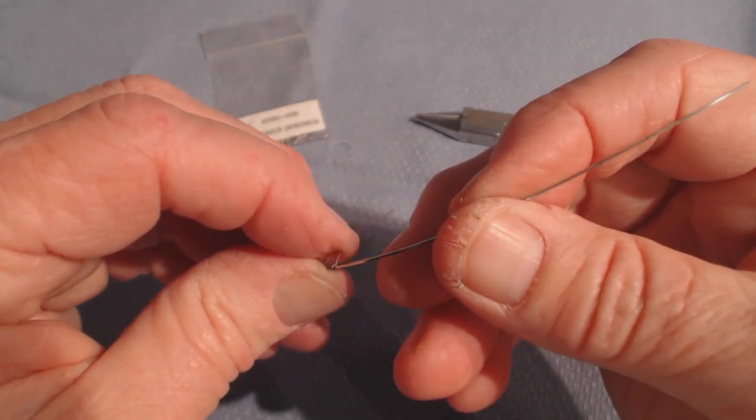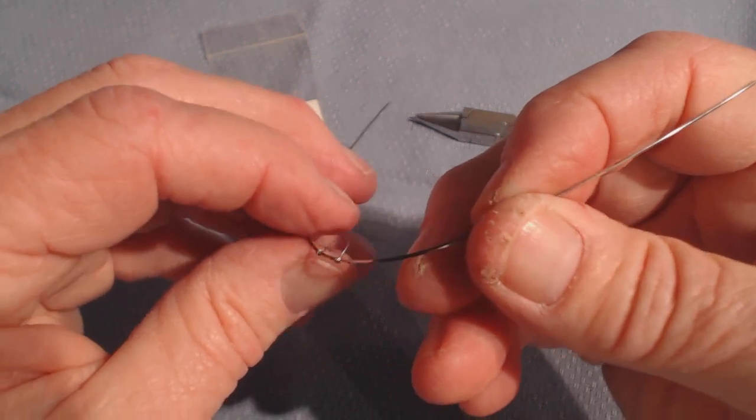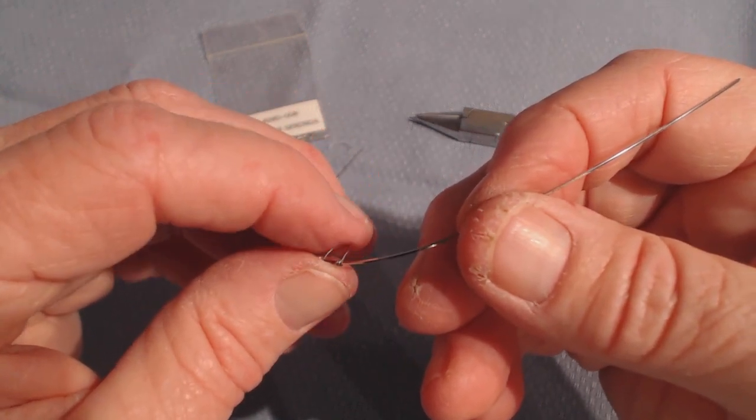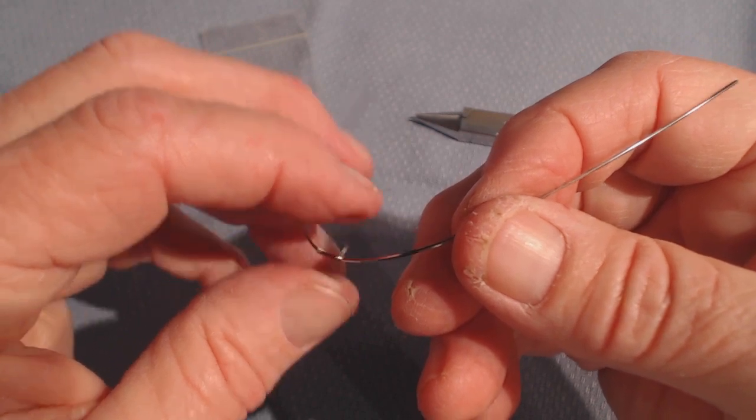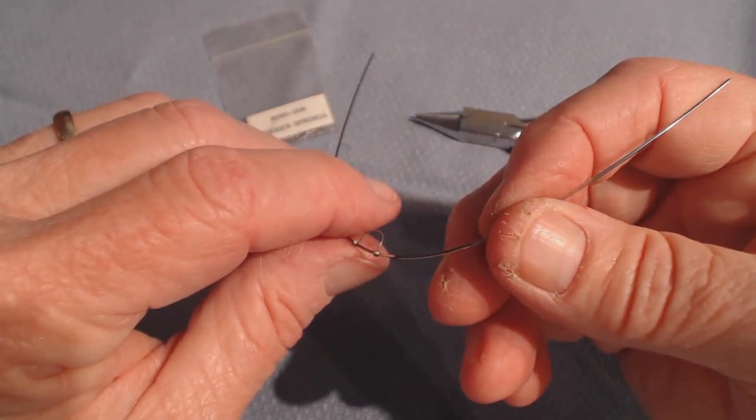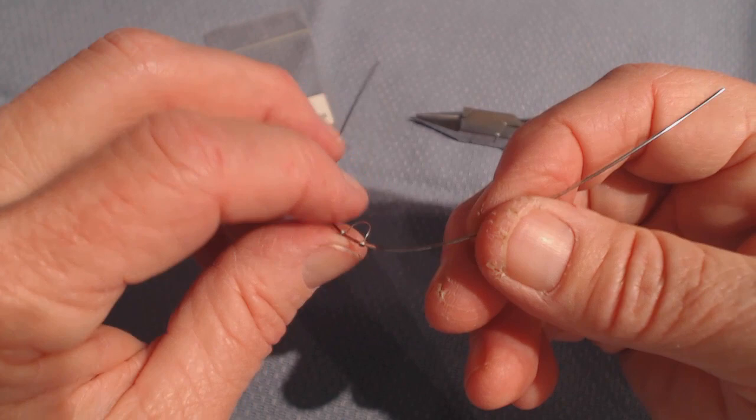So, the first one you do is a little bit daunting in there. And you can sometimes mount them upside down. You can put them on a lateral. You can put them on a cuspid. But many times you have to modify them to do that. As they come right out of the package, they are pretty straightforward to use on a central incisor. And they will cause lingual root torque on the tooth.